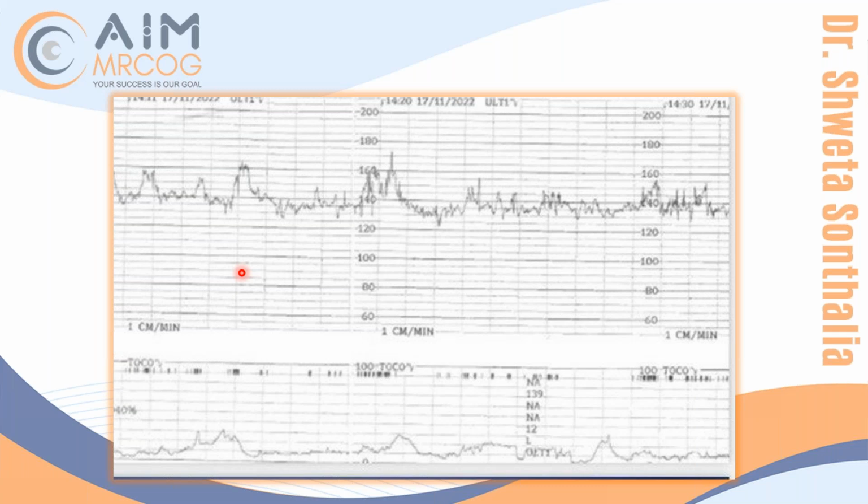Very good. You told me the baseline is 130. Are all of you convinced with that? No, it is 140. Actually, 135. Here it is 140, and then it gradually dips to 135. So 130 is not fitting well, but 135 to 140 is the baseline. Here again it became 140. So the baseline here is 135 to 140.